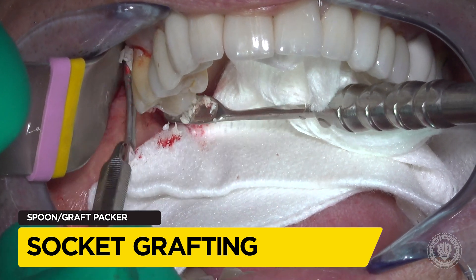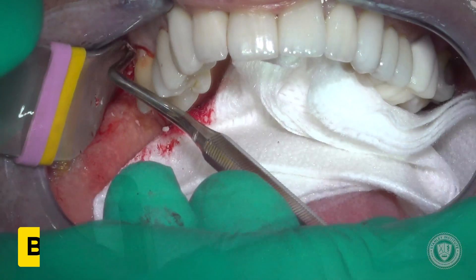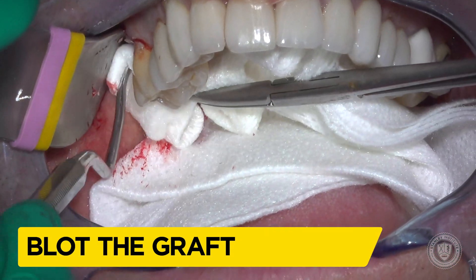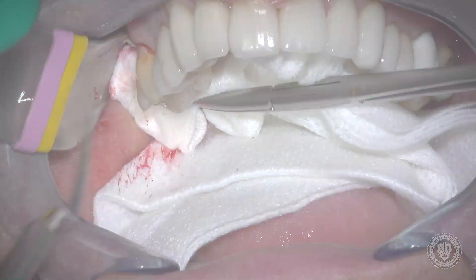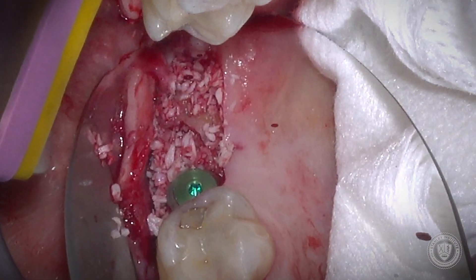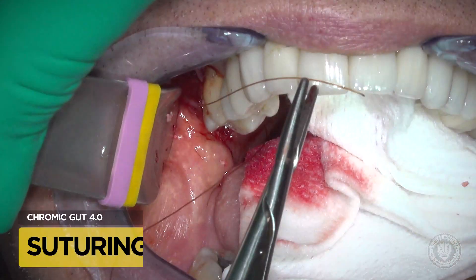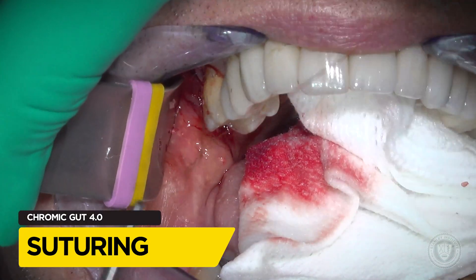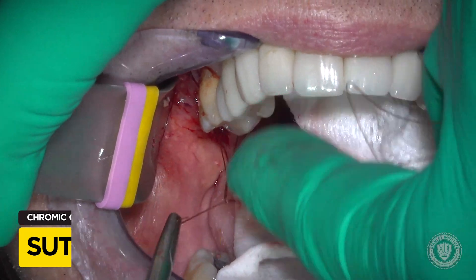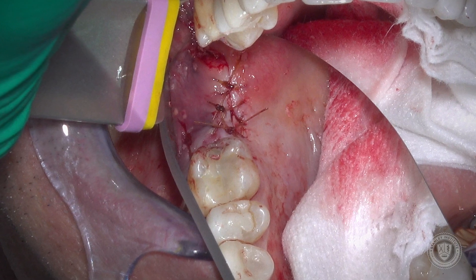We're not going to leave that hole — we're going to graft it with Mineros, which is a cortical cancellous mixture from BioHorizons. Applying a little damp gauze and putting pressure on it helps to soak up the heme. You can see we've grafted nicely distally. With bone grafts and primary closure, we want a barrier membrane, but in this case we don't want to retrieve it, so we're using a cross-linked collagen membrane called Memloc from BioHorizons.